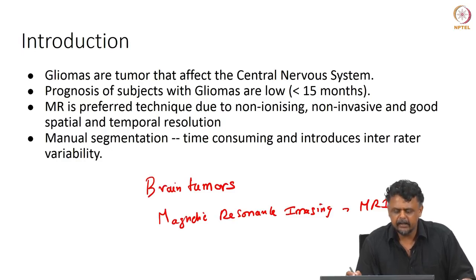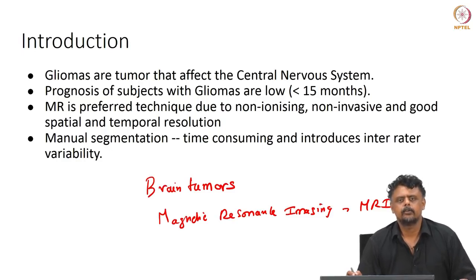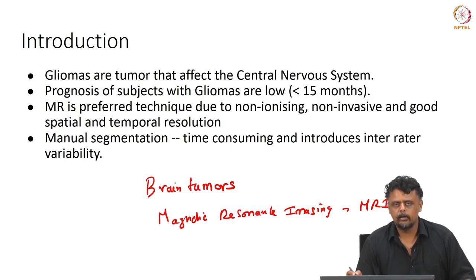So, the idea behind imaging these patients is that by imaging them you can visualize the tumor non-invasively, and by looking at the tumor, measuring its size, doctors usually use that as a marker for figuring out if the tumor is progressing or if it is responding to medication, in this case treatment.